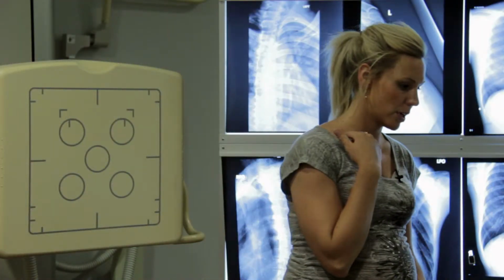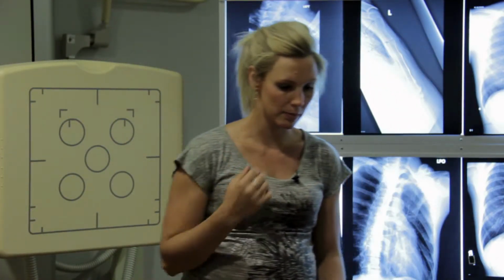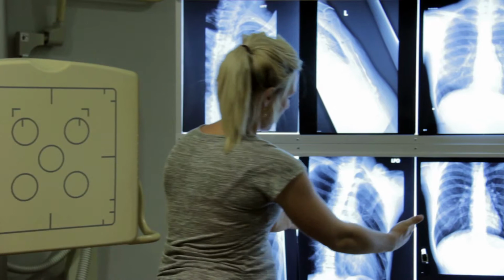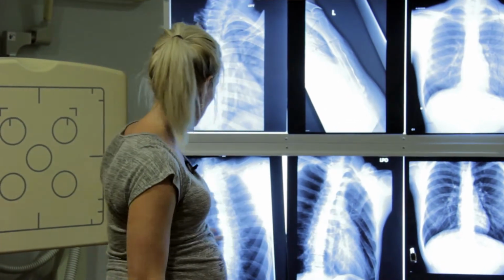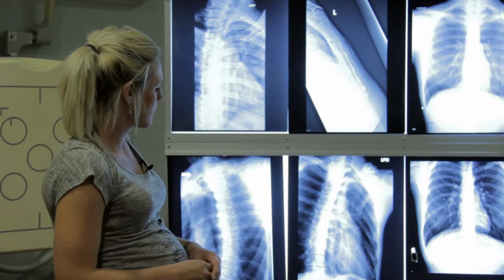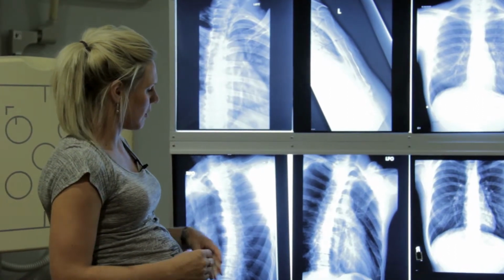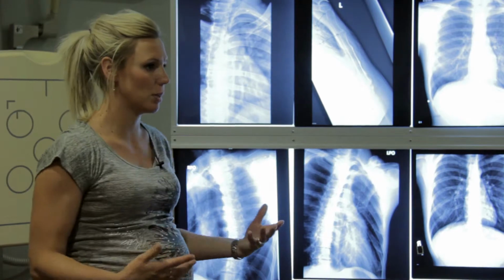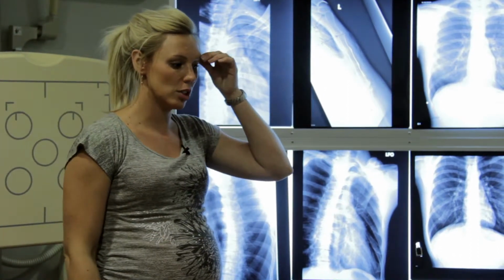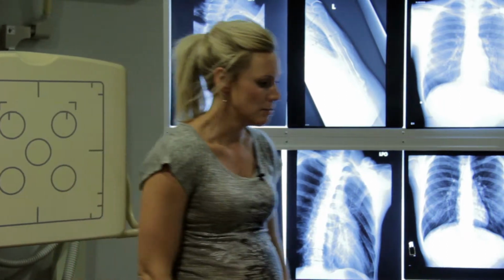Now there are a few other considerations. I'd kind of mention, like if they're real large, just do a crossways, especially if it's bilateral. If it's unilateral, you can probably, I mean, that's a pretty big film, you can probably get them. These were done at 40, you can tell how much magnification there is. So that's why we're going to be doing them all at 72. But if a patient's really big, even your obliques, you should be able to get a single side on a cassette. But bilaterals, you know, you might have to get a little bit creative.